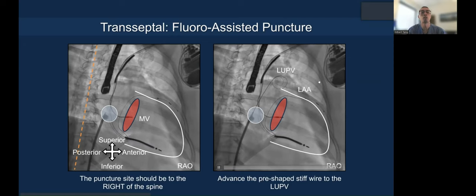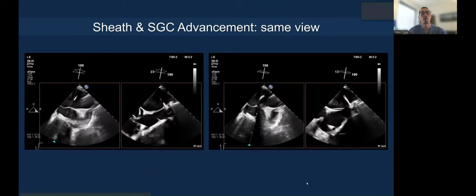Not the end of the world, but make sure you don't push too hard and risk perforation. The puncture site in AP projection is typically toward the right side of the spine. Going toward the center of the spine makes it more posterior. You then advance the pre-shaped wire to the left pulmonary vein.